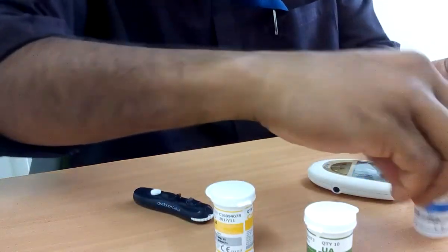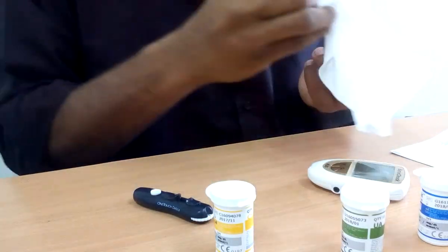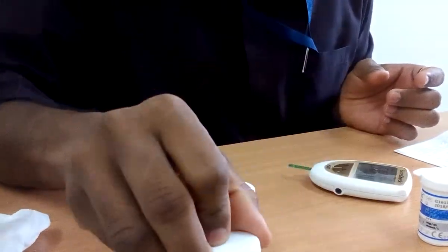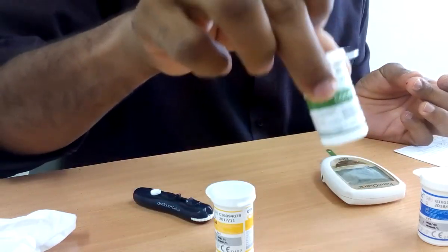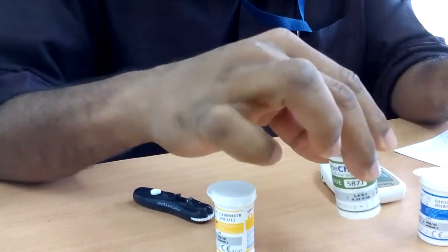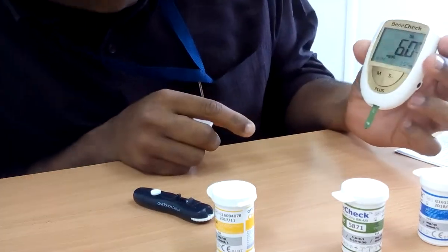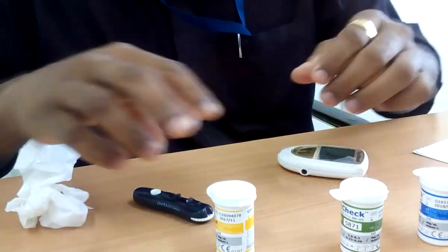Next we will check uric acid. My uric acid level — I will get a new lancet — my uric acid level is 6 mg per dl. Also, you should close the strip container quickly because it is a sterile container; you should protect it from contamination.